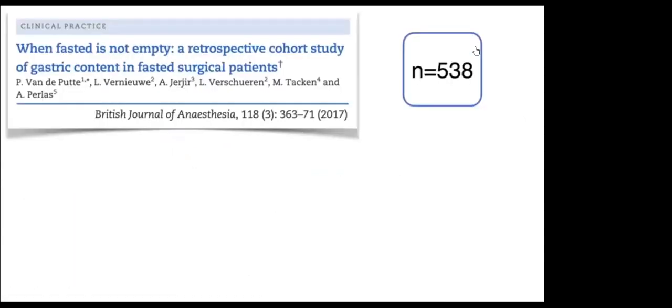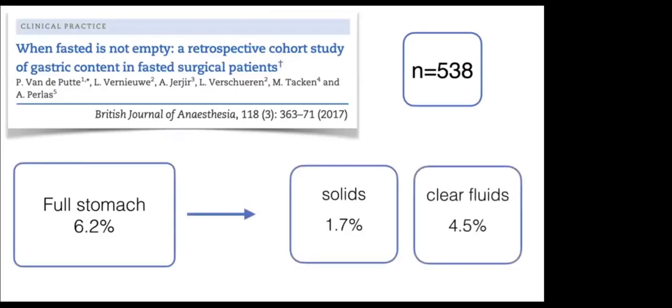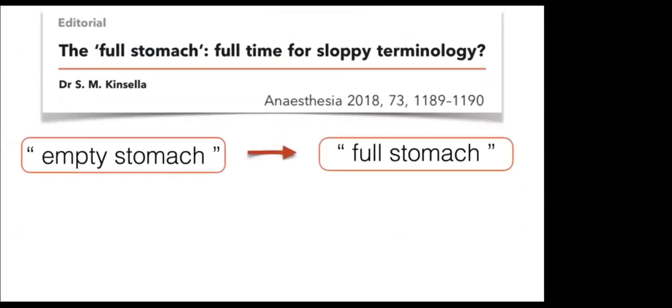When fasted, it's not empty. Even for elective patients, we can find a full stomach with the presence of solids and a significant amount of clear fluids. But one thing is an empty stomach and the other extreme is a full stomach. In between, we have different states that we have to consider.